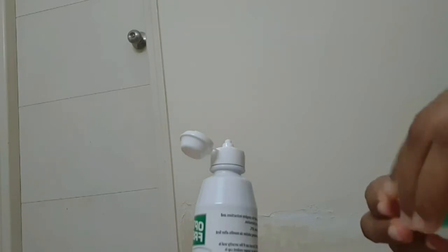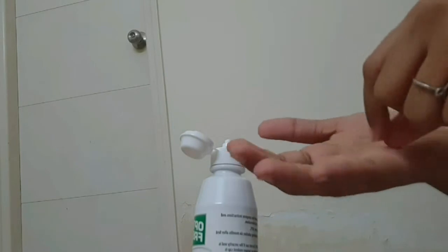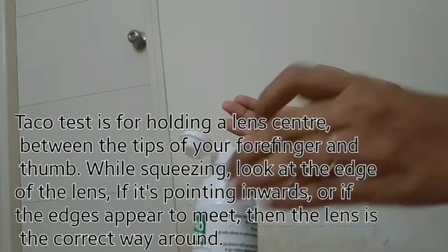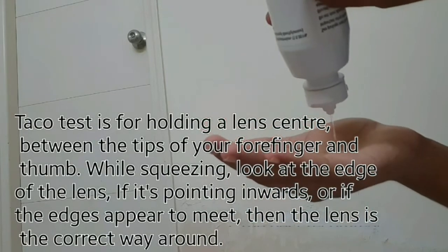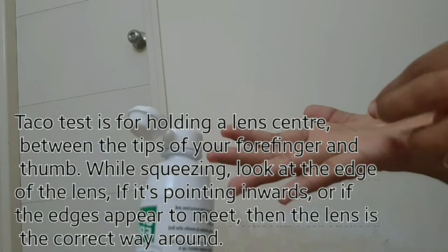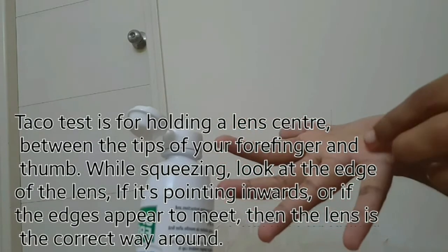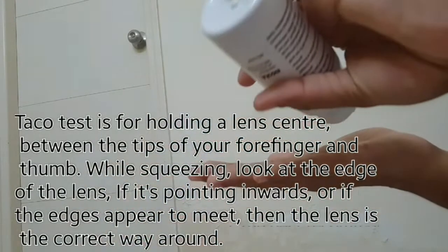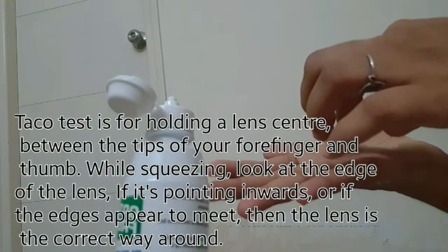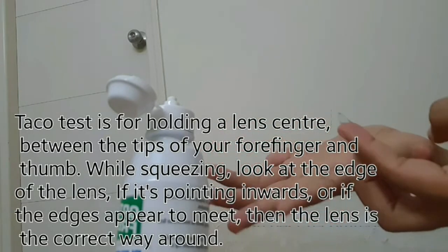Now I am going to show you the taco test. Take your lens from the case and place the lens in your palm. Use the contact lens solution recommended by your optometrist, then rinse the lens back and forth. Make sure it is free from dirt and tears.